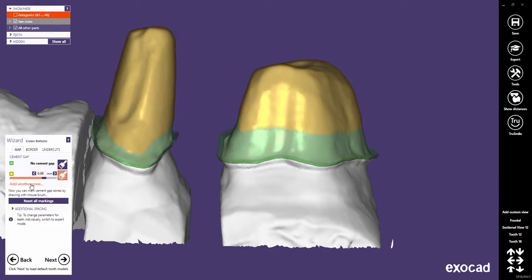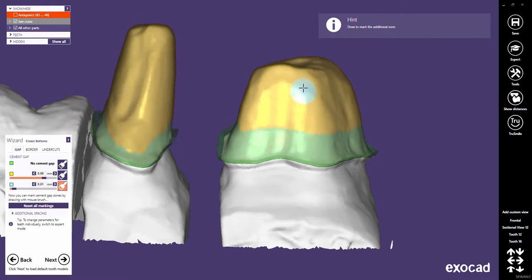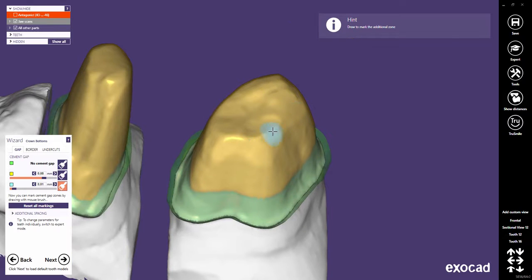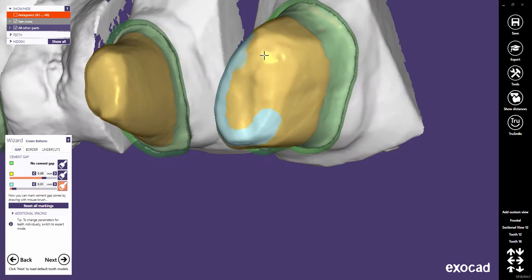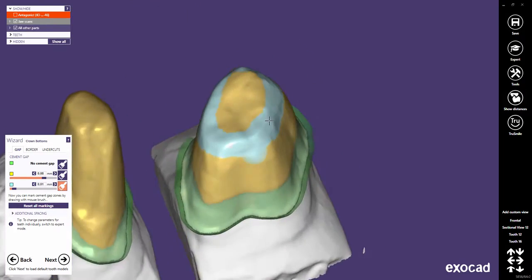It is also possible to add an additional zone, and to choose an individual cement gap for this separate area. This function could be used to increase the block out thickness on sharp edges.